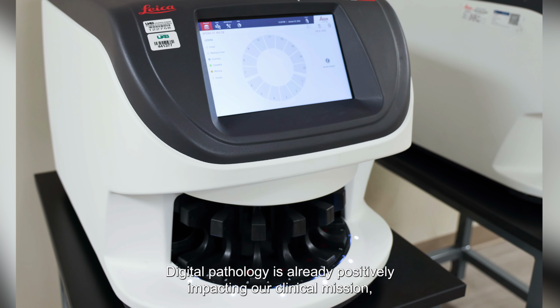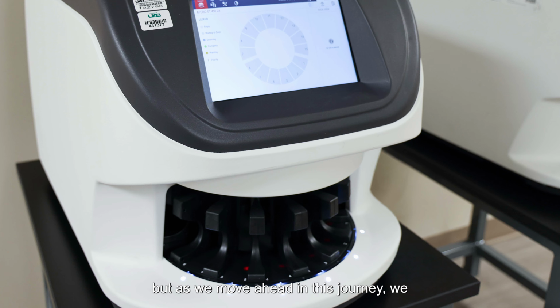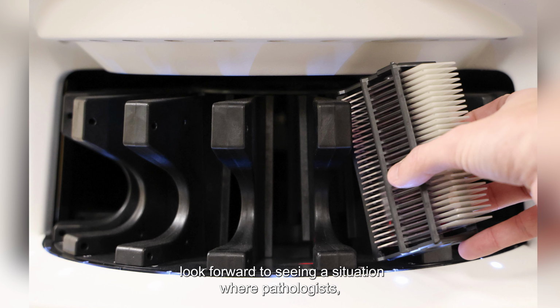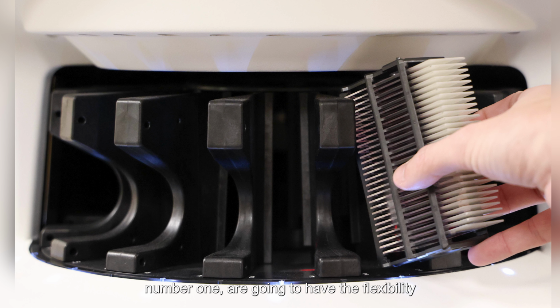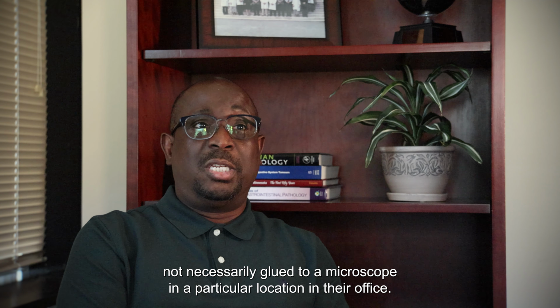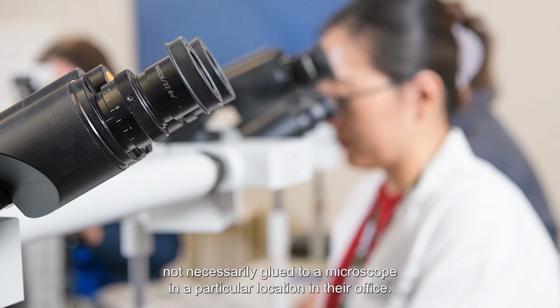Digital pathology is already positively impacting our clinical mission, but as we move ahead in the journey, we look forward to seeing a situation where pathologists, number one, are going to have the flexibility to access patients' material in different environments, not necessarily glued to a microscope in a particular location in their office.